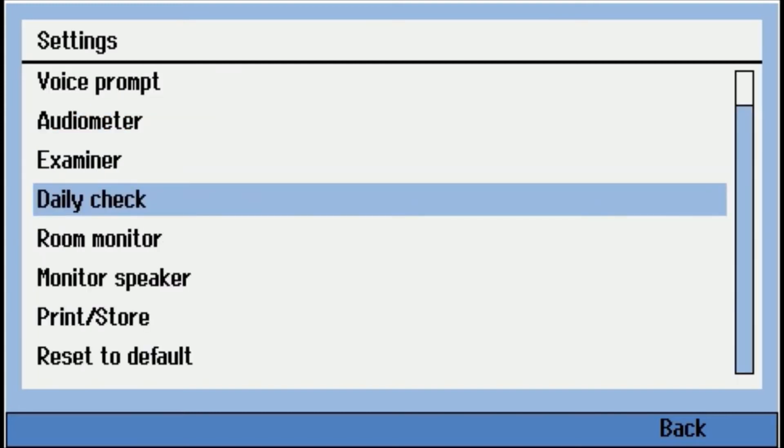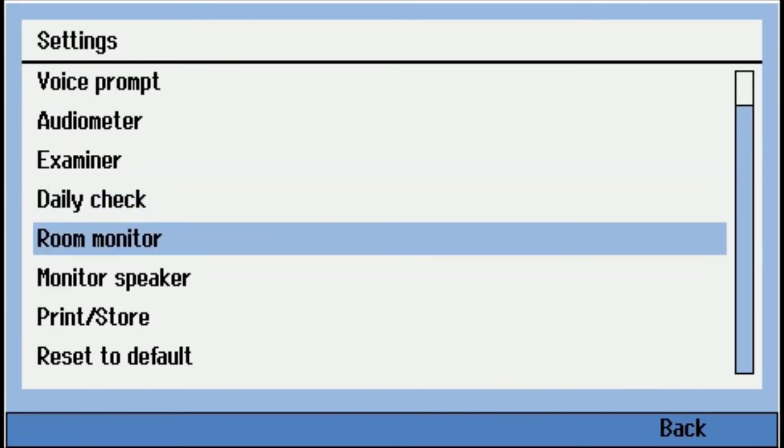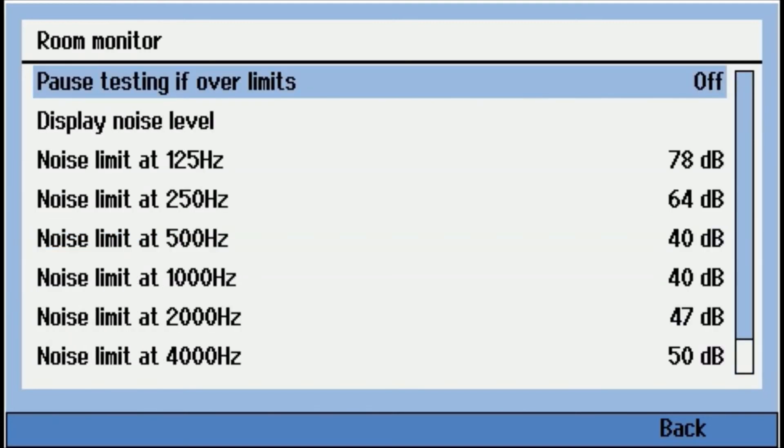Room monitor. So the RA360 is the only audiometer at this price point on the market that will run monitoring the ambient noise without a PC requirement. So you can pause the test if it gets over limit, turn that on or off. And then your different limits at the seven octave bands that it's checking.